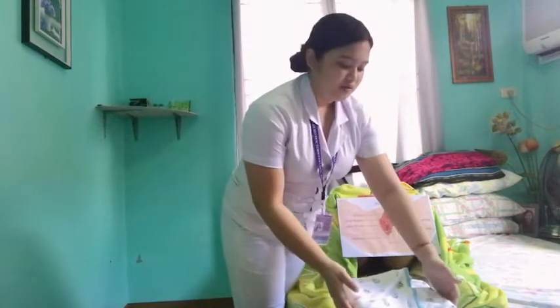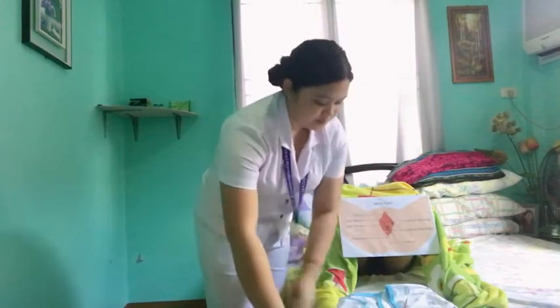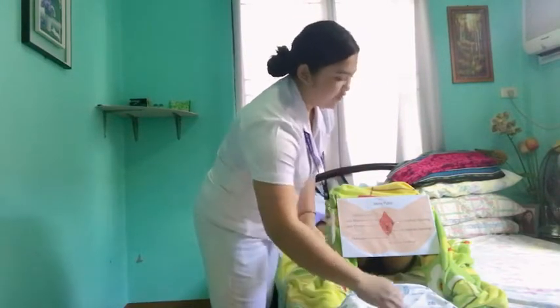We have the tray here, and arrange your equipment for convenience and accordingly. So to avoid the contamination of the sterile items, placing the equipment in order will increase the speed of performance. Also, reaching over sterile items increases risk of contamination. So observe for the sterility of the items. So we have our forceps here.